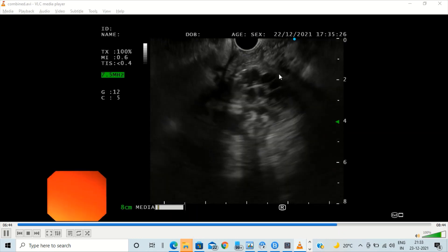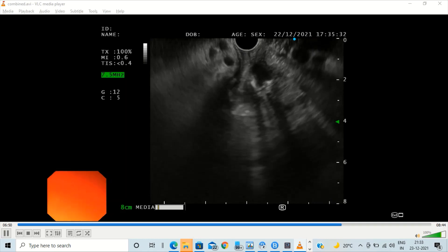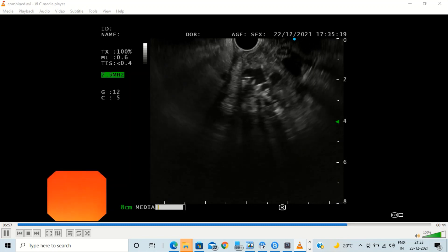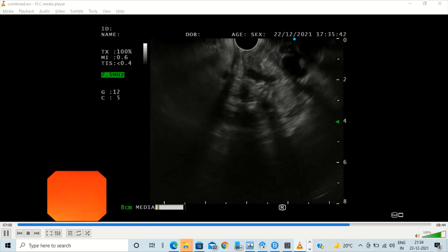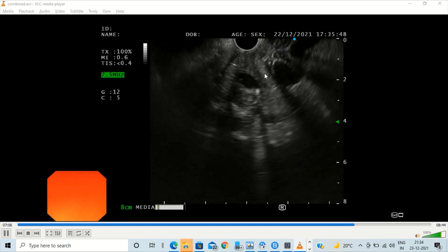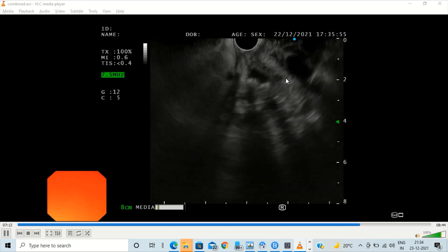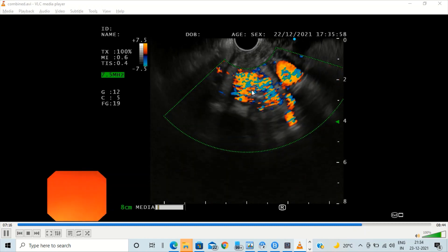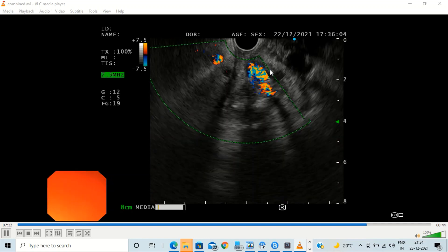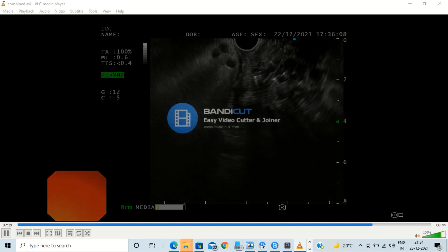We continue to observe the area. We can see there are still some remnant variceal luminal areas. It is important to continue to observe because the flow will decrease with time. We are also confirming that nothing is embolizing away into any of the bigger perforators, and the coils remain in position. On Doppler, we find there is still some persistent residual blood flow in this area despite having put in 2 coils and 2 ml of glue.